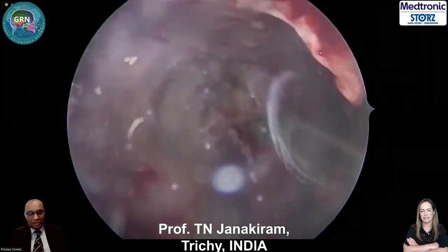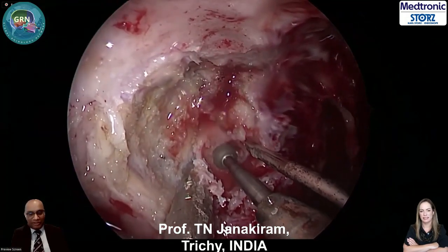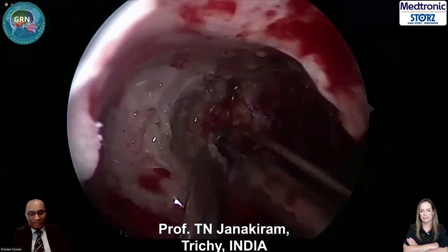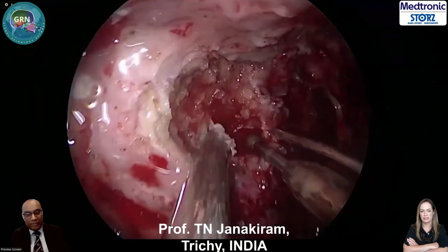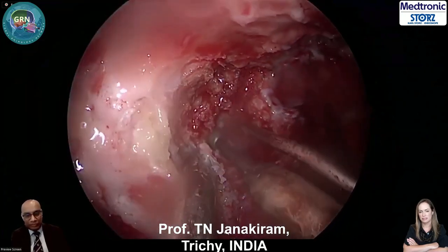Okay, now where am I? Where is that? That is the pterygoid fossa, otherwise called the transpterygoid space. On the scope. On the drill. On the scope.